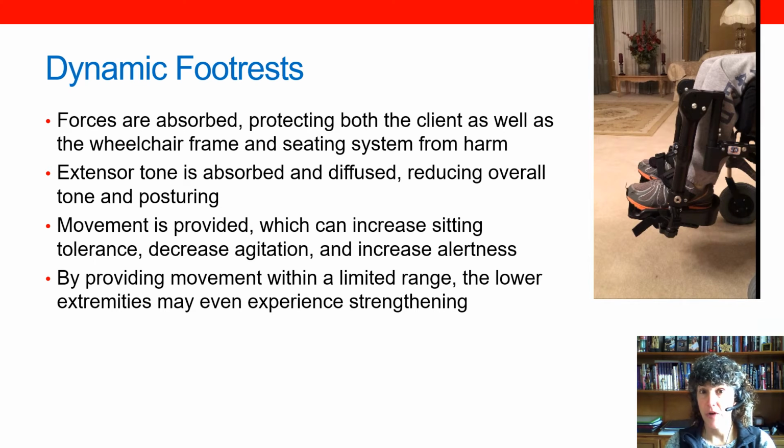Movement is provided at the knee, and that can increase sitting tolerance because we're just more comfortable when we can wiggle those knees around or those legs. We might notice decreased agitation and increased alertness in clients who have this movement as well. And then finally, by providing movement within a limited range against light resistance, we can actually see an increase in strength in many clients.